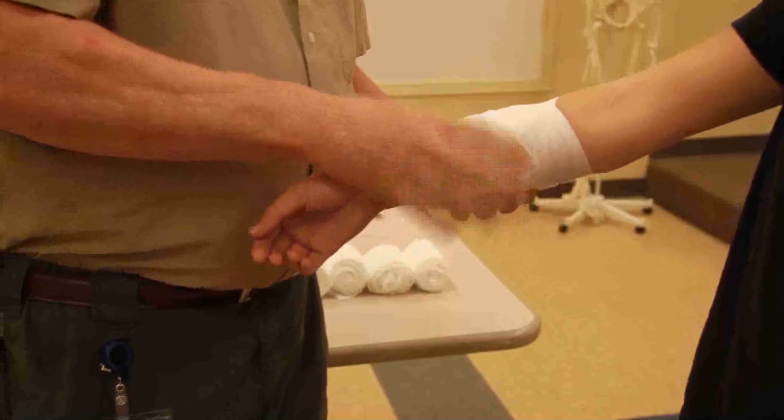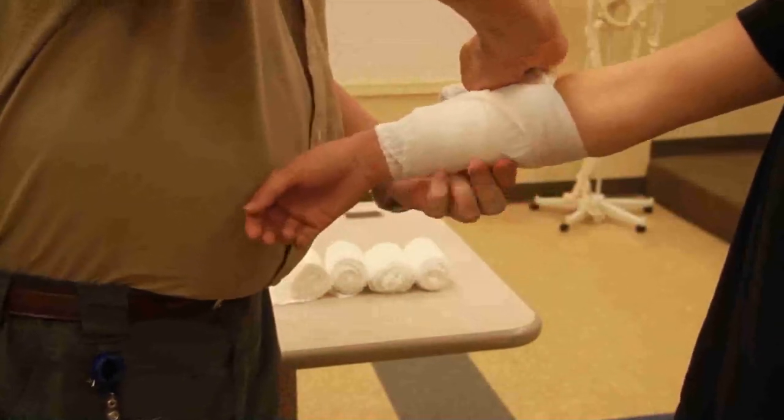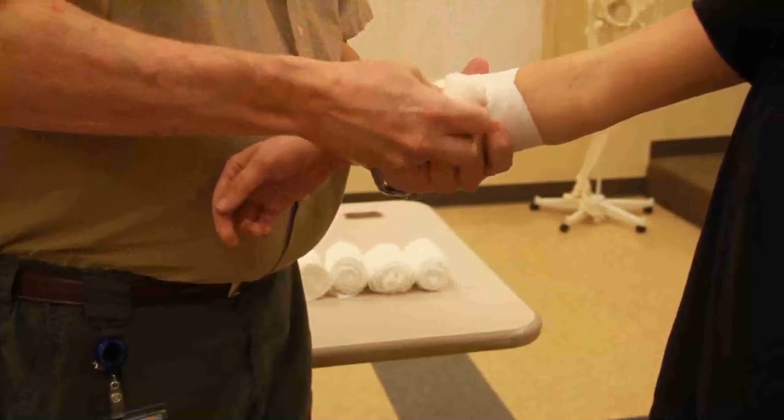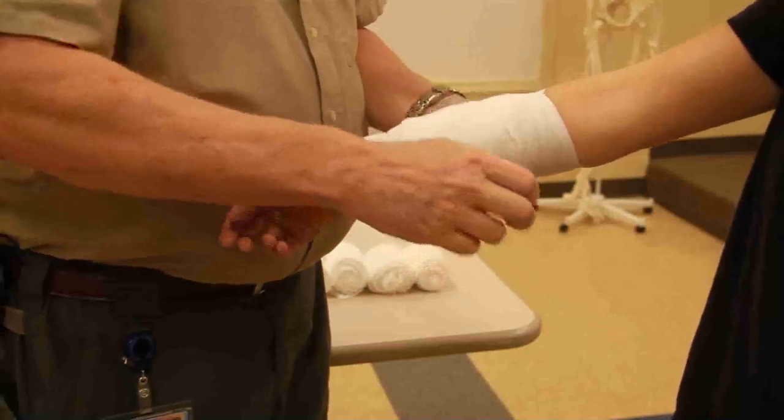I'm going to come around, being careful not to drop my roller gauze, because if I do then I've lost the ball game — and it's a lot easier to drop when you're rolling backwards. Now I'm rolling forwards again.